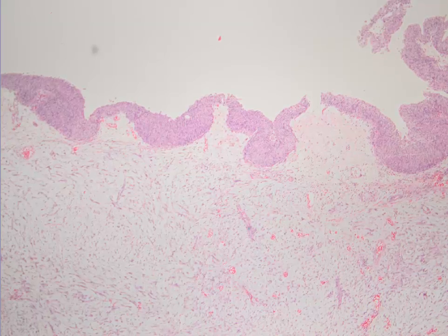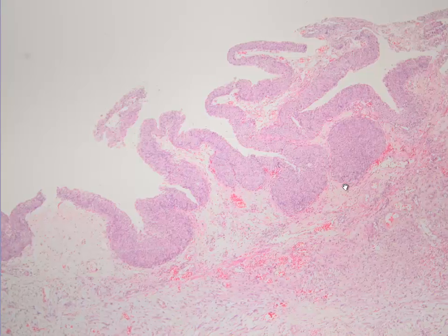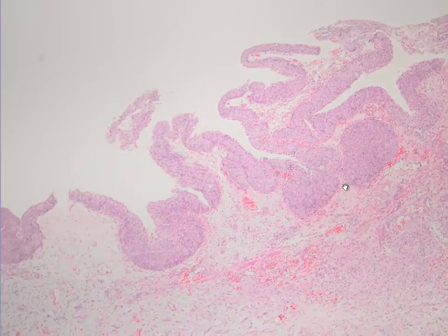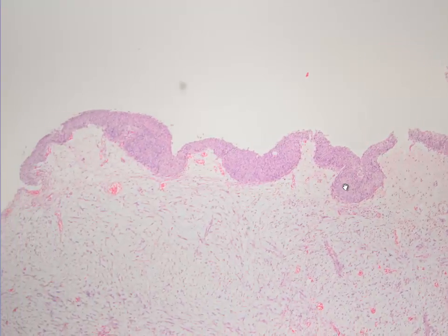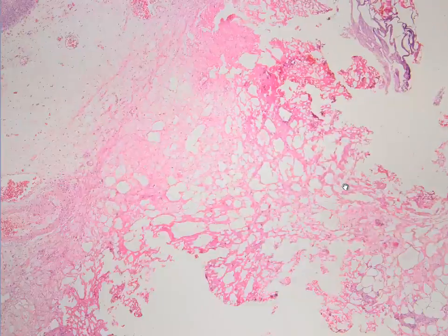Today's case is a 40-year-old male with a bladder mass. So we have here a urothelium with some papillary-like formations. These are not real papillae, but just the undulation of the surface urothelium. And just beneath the urothelium, we have this spindle cell proliferation. Looks like a little bit edematous, but certainly this is a spindle cell proliferation.